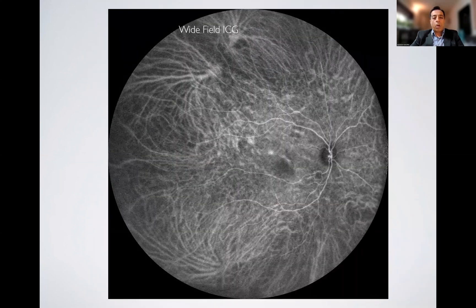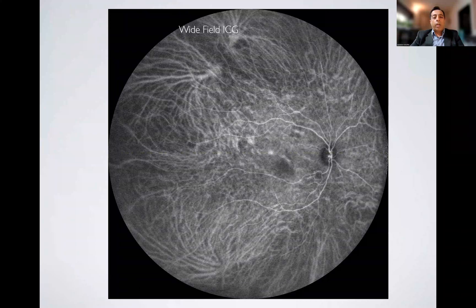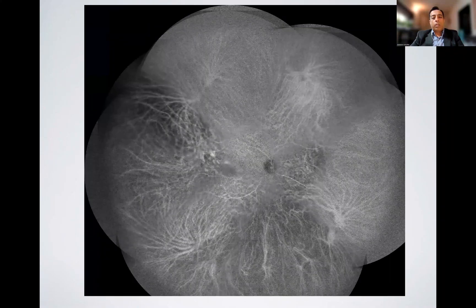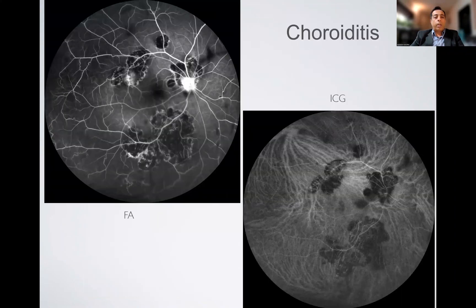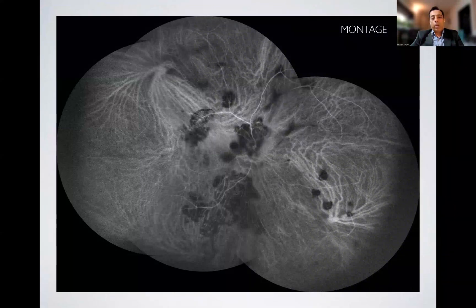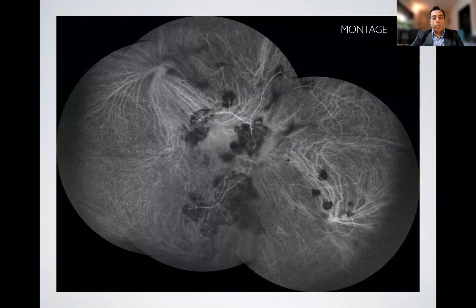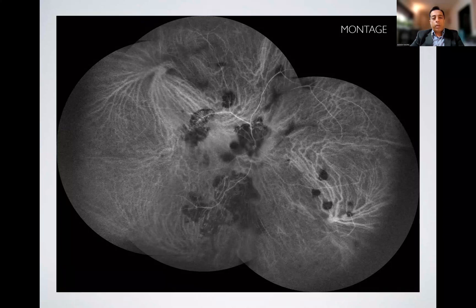When we use ICG, this is a normal ICG — in a patient you can see clearly the whole vasculature of the choroid, and you can do a montage for a still wider field by putting these images together. It's most useful in conditions like choroiditis, where you can see the extent of lesions in peripheral areas apart from the macular area. Look at the extent when you do a montage of these wide-field images of the active areas.